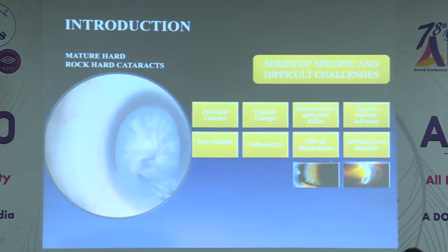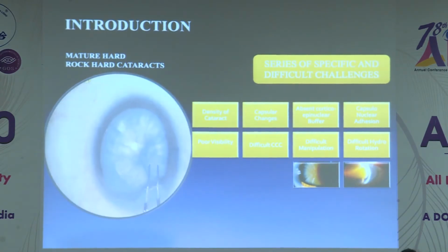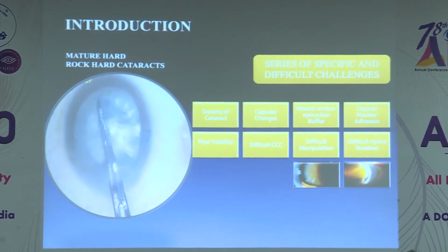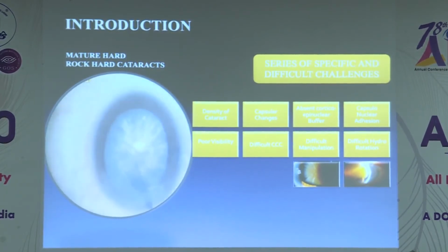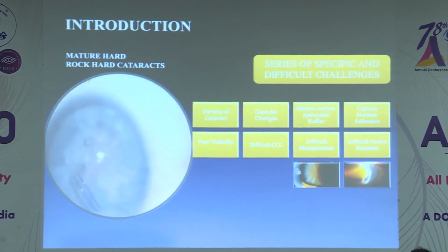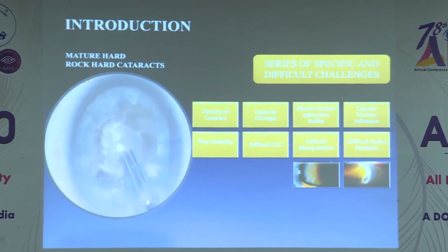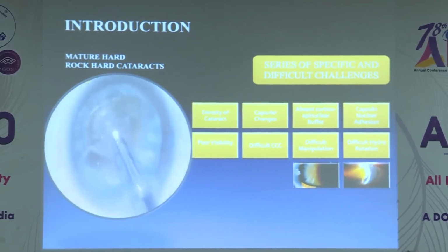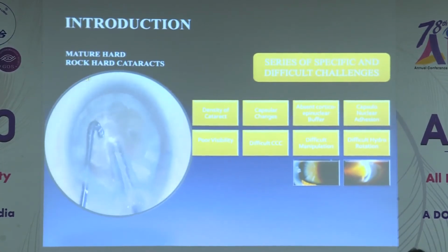So it gives you a problem in visibility because you don't have the glow behind, so visibility is very low. The capsular changes make it difficult to produce the capsulorhexis, and if you have absent cortico-epinuclear buffering material, then you are very close to the posterior capsule. All your maneuvers directly hit the posterior capsule, and you may land up with complications. If there is adhesion of the capsule with the nucleus, then your hydro procedures become very difficult, and if you inject too much fluid, you can open up the posterior capsule. So these are the problems we come across in hard cataract.